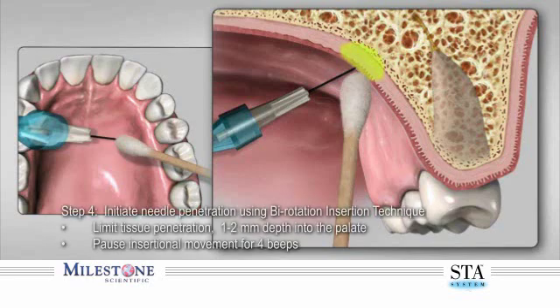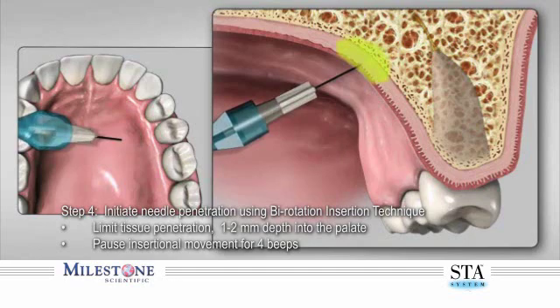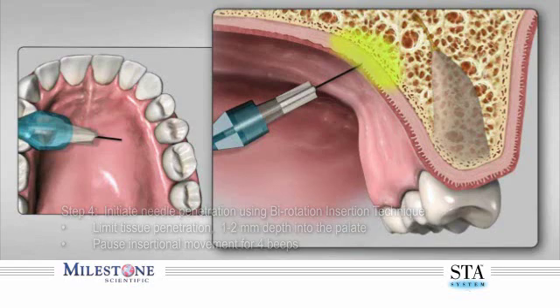Step four: rotate the handpiece back and forth with slight forward movement to allow a shallow puncturing of the tissue to a depth of one to two millimeters. Then stop forward movement and allow the STA system to continue to deposit anesthetic for an additional four beeps before any further tissue penetration. You have just performed what Milestone calls the pre-puncture technique.